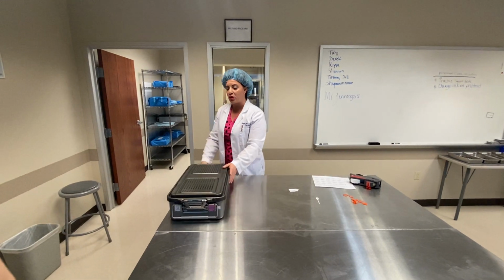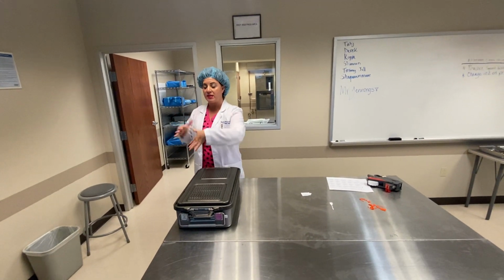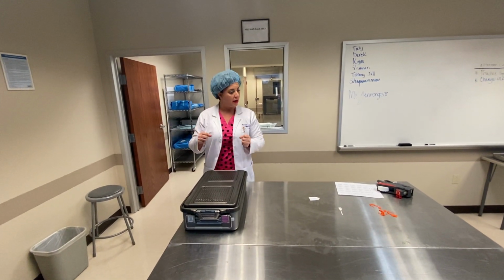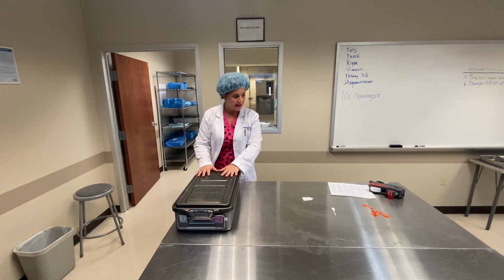Okay, so now at this point, this card would be in here, and then this would get loaded into a big rolling cart. And then as soon as that cart was filled, it would be pushed into the sterilizer for sterilization. And again, this uses the steam sterilization process.